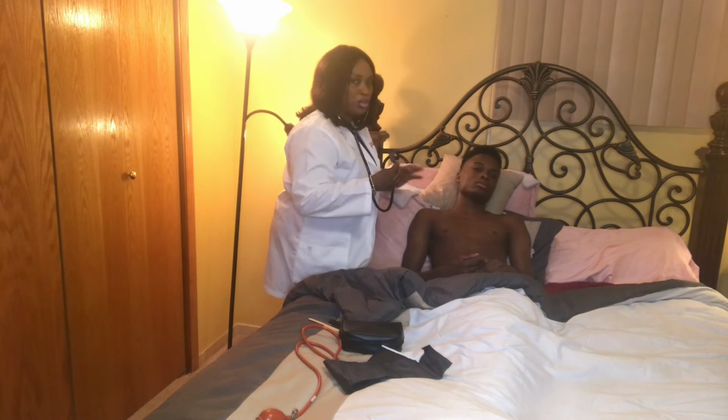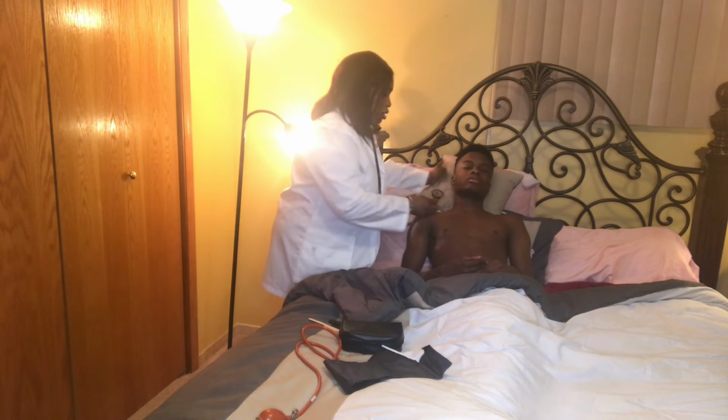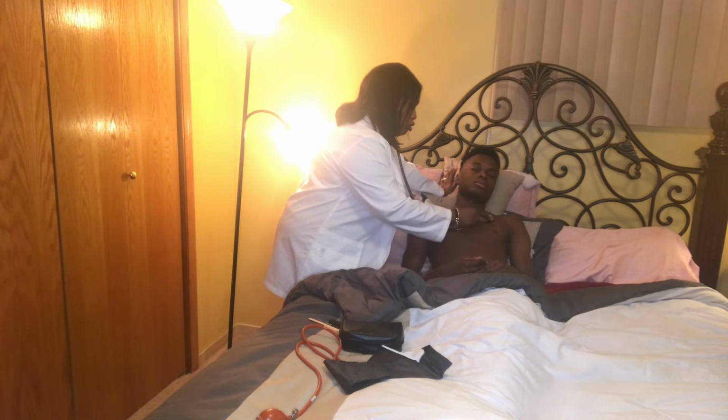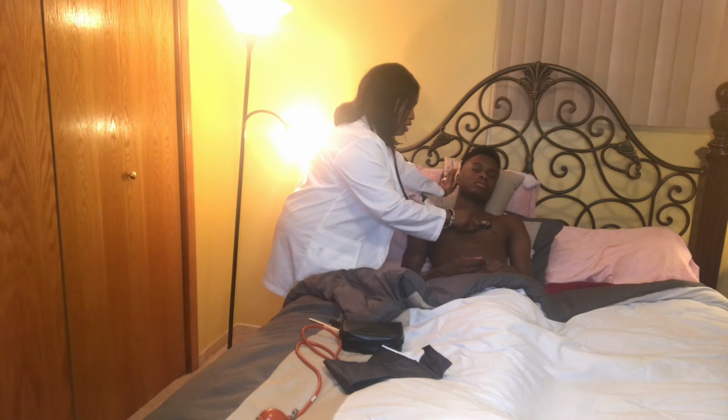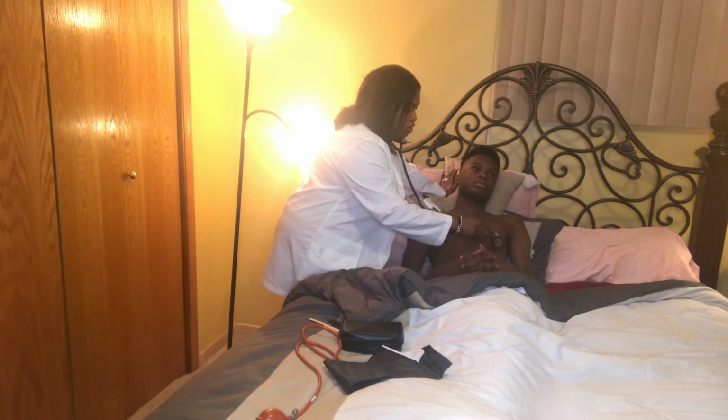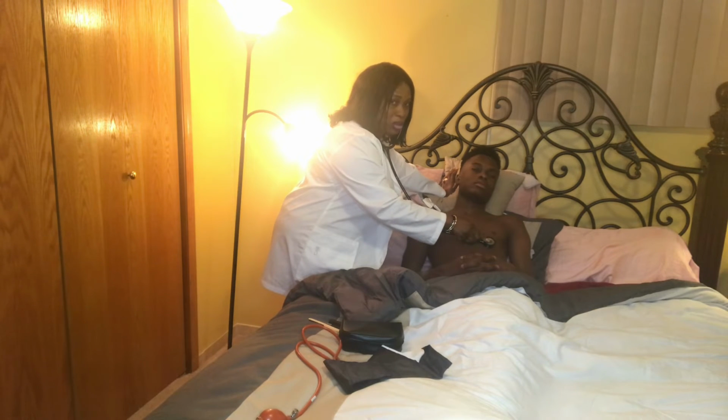And I'm going to be also listening with my bell, my stethoscope bell. I'm coming to the right side, which is the aorta. I'm listening. And I'm also moving to the left side, second intercostal space, which I'm listening to the pulmonic. I'm moving to the third intercostal space, which I'm listening to the Erb's point. And I'm moving to the fourth intercostal space, which I'm listening to the tricuspid valve.